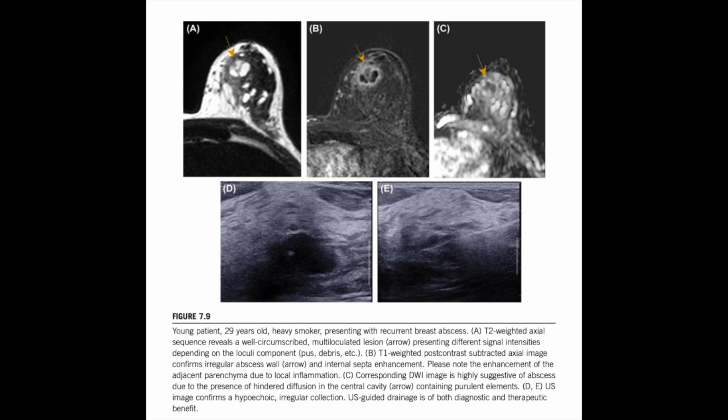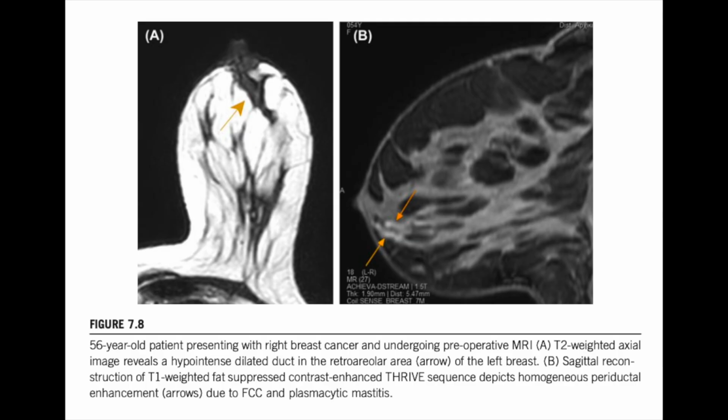And what about long term? Years down the line, how do you know a chronic scar isn't cancer? Because scars can look distorted forever. They can. But chronic scarring stabilizes. It should reach a stable size or even decrease after about 2 years. The most reassuring sign long-term is the absence of uptake after contrast. No enhancement at all. A stable, spiculated scar that shows zero enhancement, it's virtually always benign. That's how you can differentiate it from a recurrence with very high accuracy.